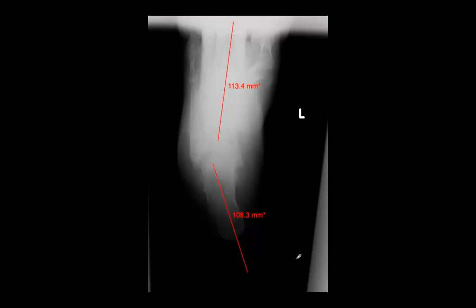So this would be calcaneal inverted. So I'd say it's a pes cavus foot as well. Yeah, and you can see that the posterior facet of the ankle joint is there, so it bisects like that. So this one doesn't have a lot of varus to it.